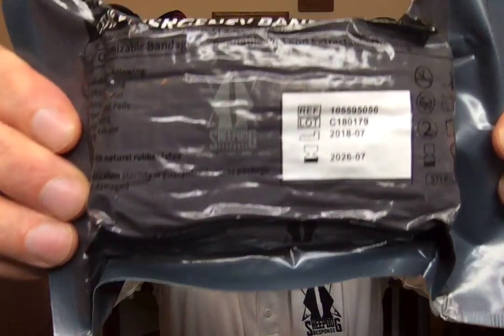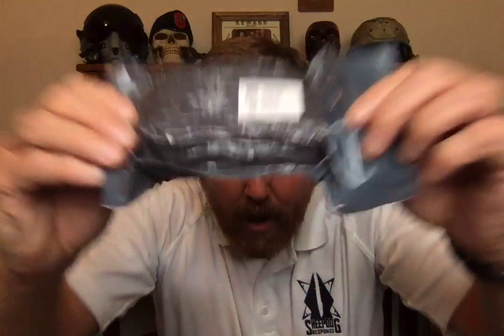It's got the Sheepdog Response logo right there on the bandage, and we are going to be selling this effective immediately at the Sheepdog store. This has all the features of the classic Persis Israeli pressure bandage that we've all come to know, love, and trust. It has the patented pressure bar and the patented closure bar — all the normal features of the Persis Israeli bandage are there. This is battle proven in the Global War on Terror overseas in combat, as well as in many CONUS locations. We know that this design works.